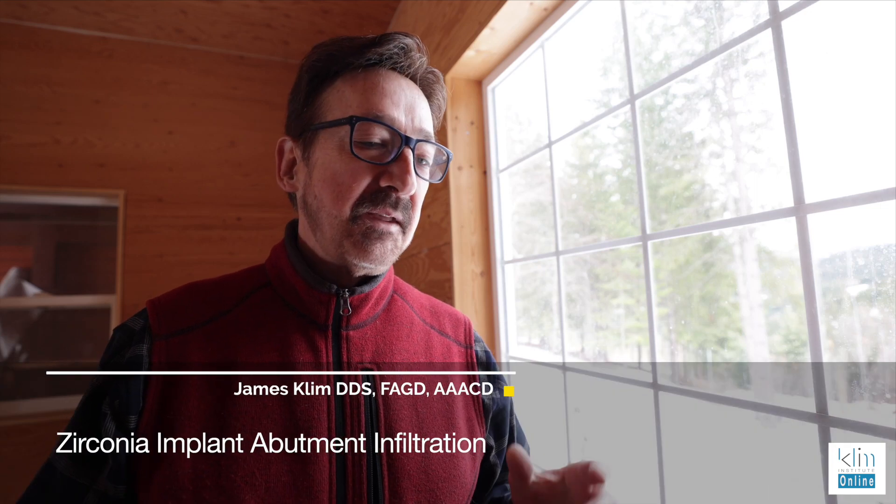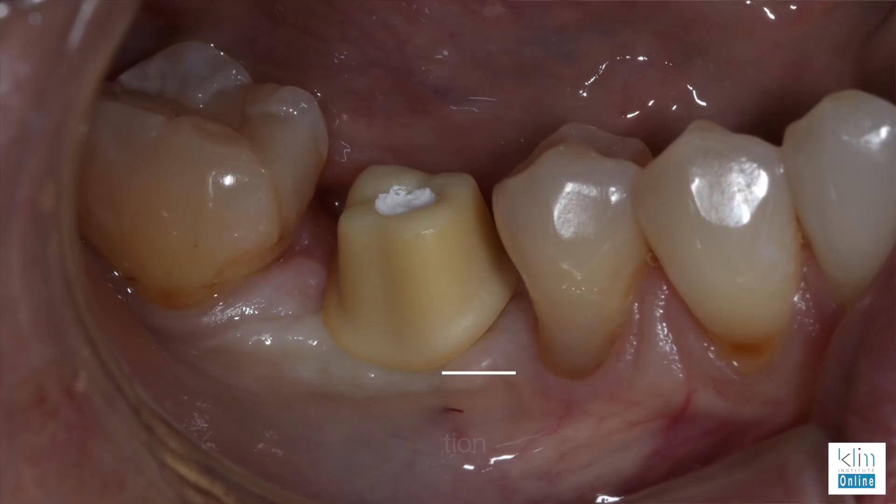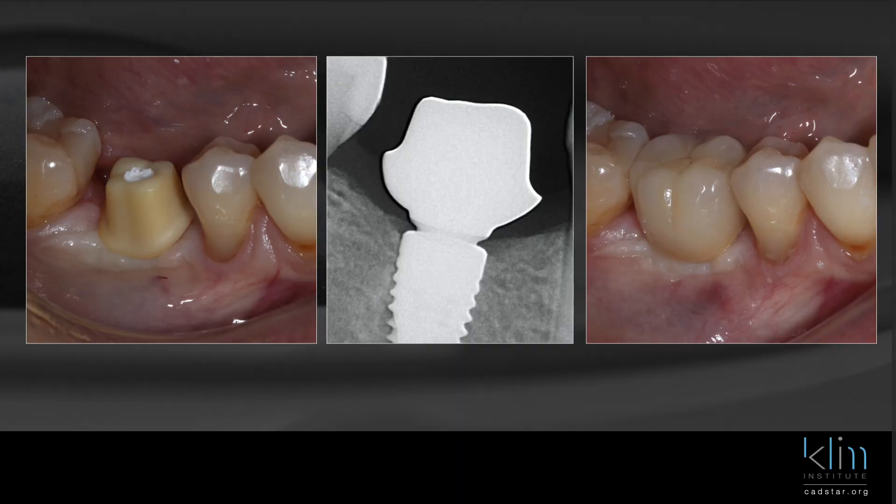Hi, my name is James. The topic for this video is about optimizing a zirconia abutment so we can get a good color on it. Usually zirconia is really opaque. Our abutment material is a three-Y material, which means it's really opaque. Sometimes it's hard to get that to work aesthetically.